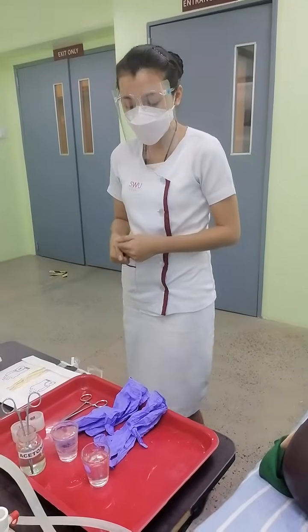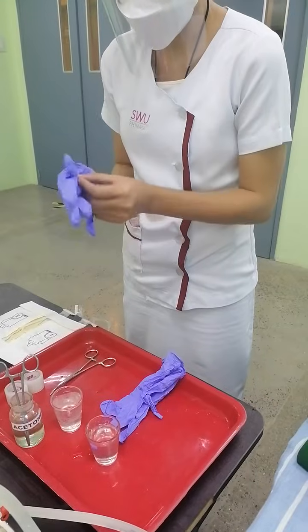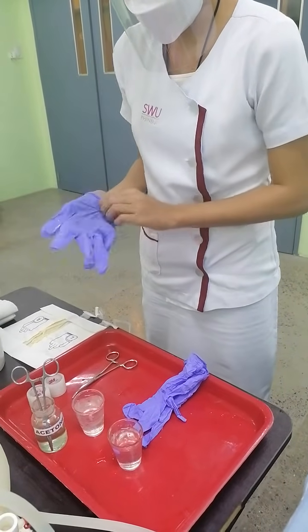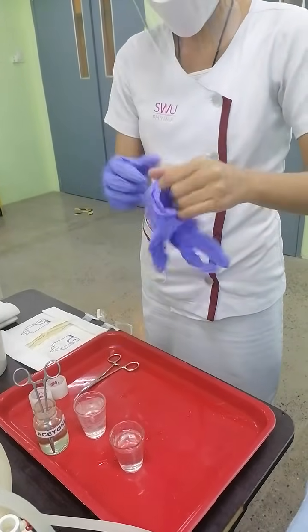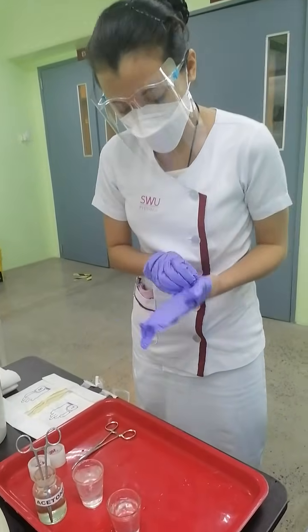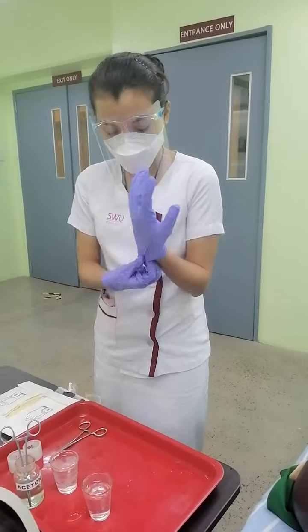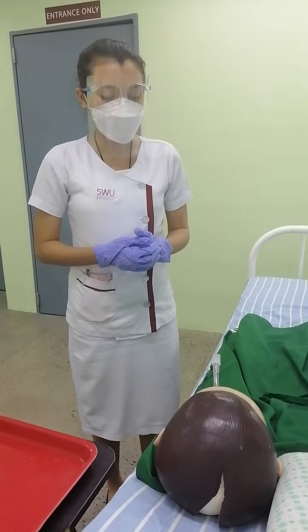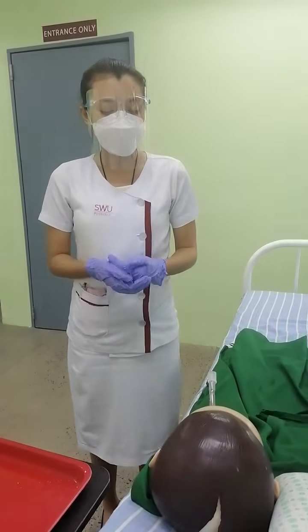Next, I will perform hand washing and put on my clean gloves. The purpose of this is to prevent cross contamination and to protect myself from the oral secretions of the patient. After this, I will explain to the patient the purpose of the procedure. The reason for this is that when we explain the procedure to the patient, we are exercising the patient's right to be informed and it lessens anxiety.